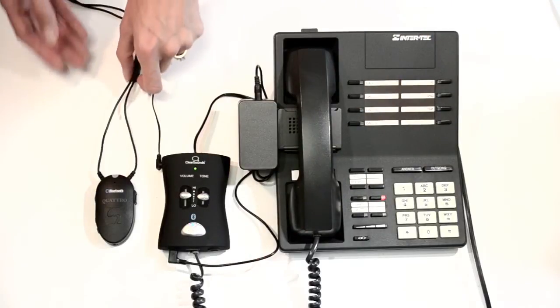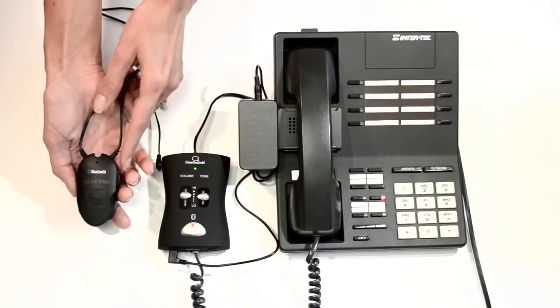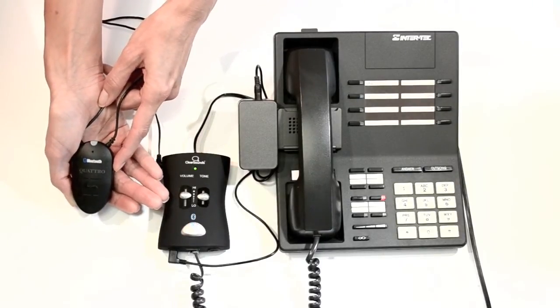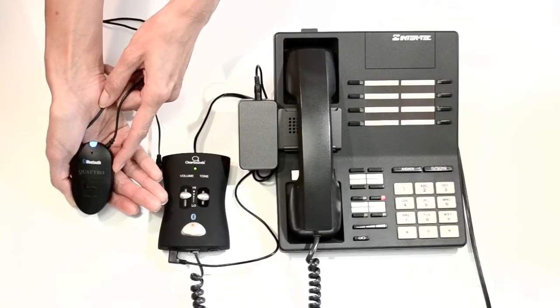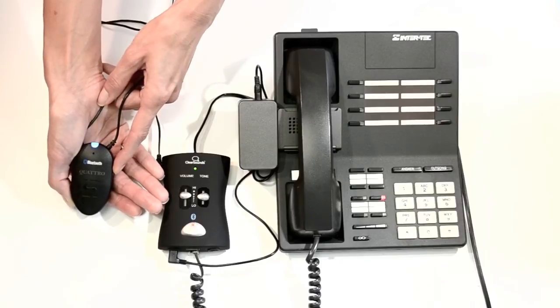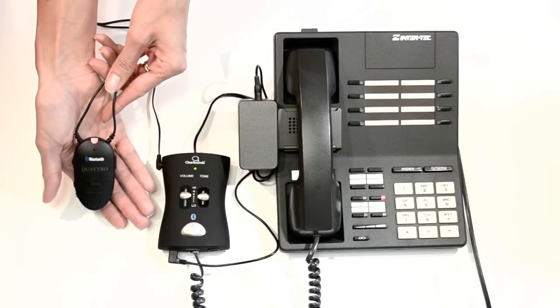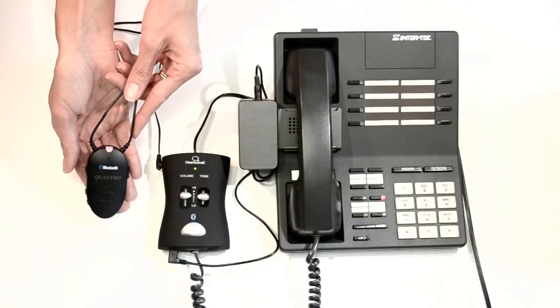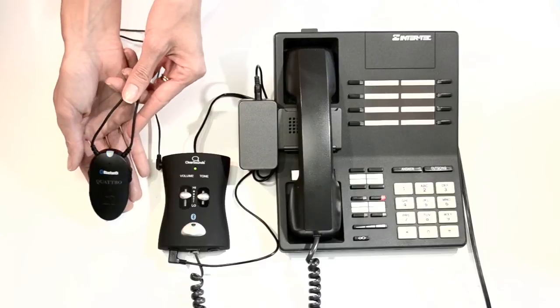Turn on your listening device and put it in Bluetooth pairing mode as well. When the hub and listening device are paired, the hub flashes a blue light every 3 seconds. Your listening device also indicates when pairing is successful.